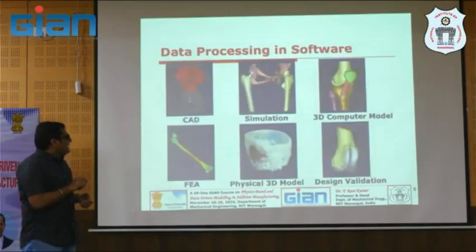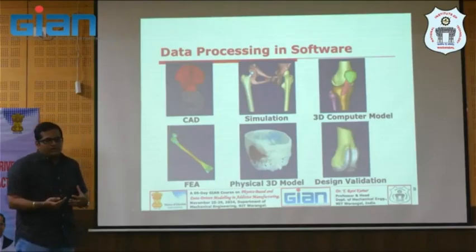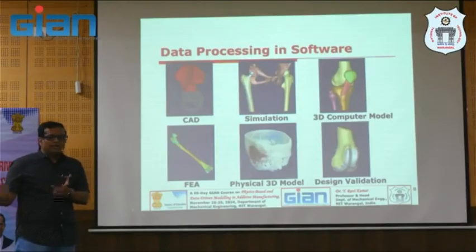And then you can transfer your data back and forth to the CAD system or to the medical image processing, vice versa. Why? Because we need to design a customized implant. So AM is meant for customization, personalization. That is very much needed for medical applications. Each person is unique in his anatomy, right?